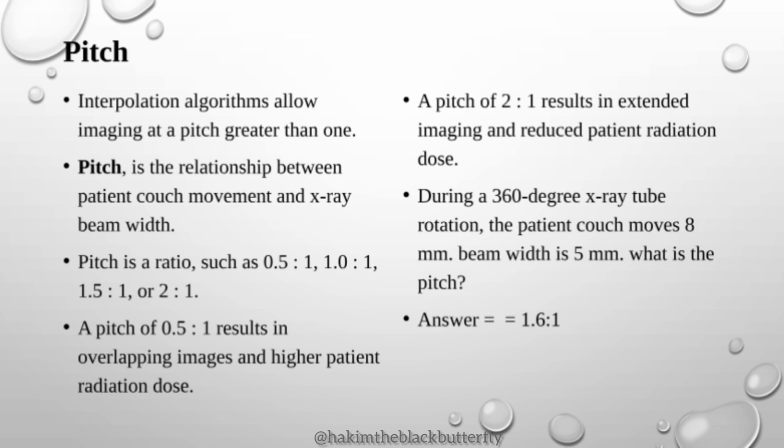Sometimes the table movement may be at a higher speed if you compare it with the tube and detector rotation.